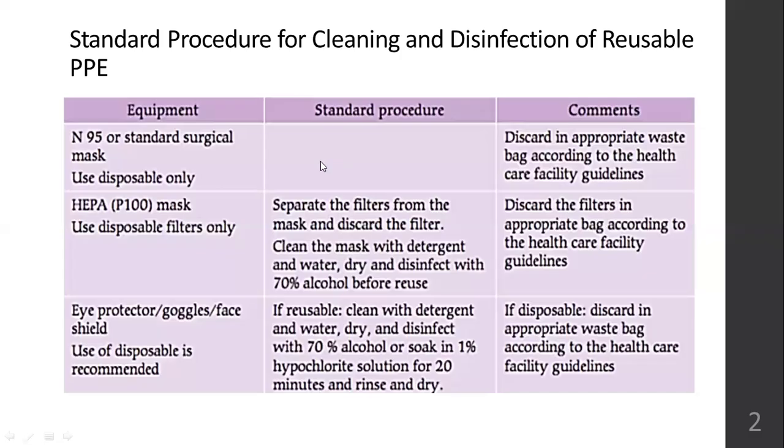If you are having an eye protector, goggles, face shield, it's recommended that you use the disposable one. If disposable one you are using, discard it after every use.